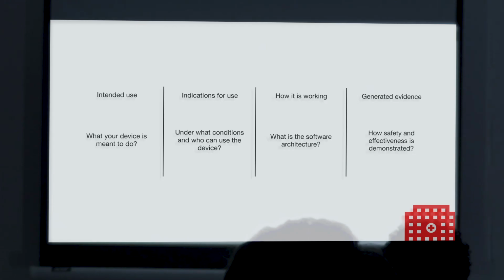It might not seem a big deal that your algorithm doesn't care what particular type of patient there is, but there are always caveats to that, so you have to be very precise in identifying what particular population you're targeting and why.